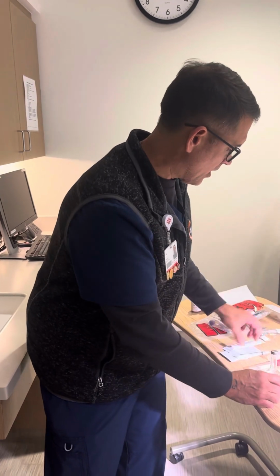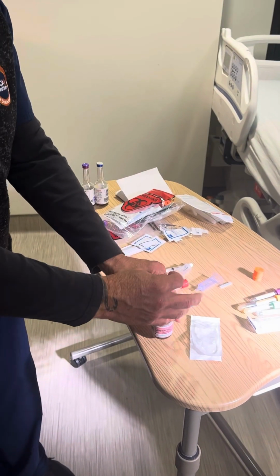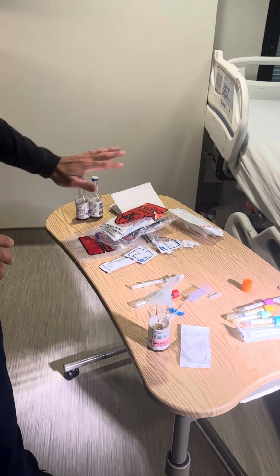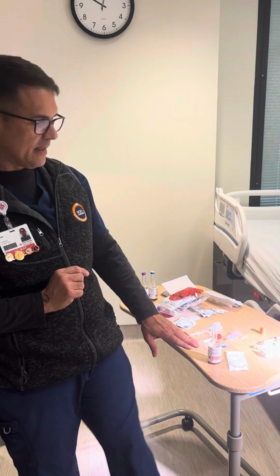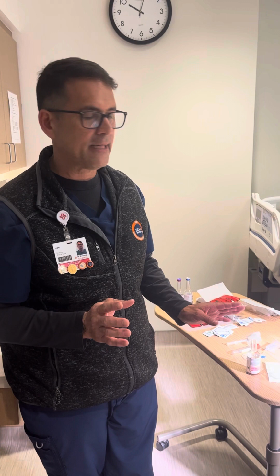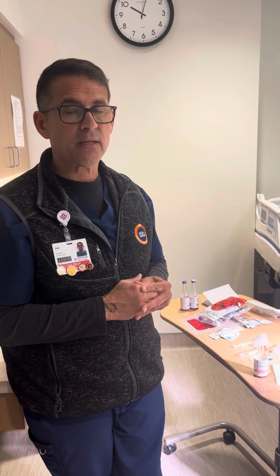Also, before I even start, always grab a little bit of alcohol and I just swab it and leave the pad right on top until I'm ready to transfer that blood in there. Same thing with the other ones. You want to make sure you clean that. And 1 ml is enough for here. I wouldn't worry about getting any more than that. 1 ml is plenty.